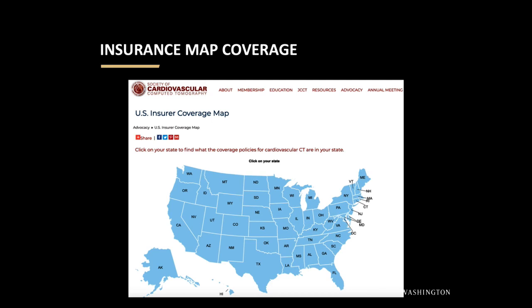So Hans, it seems like in the PROMISE trial, a lot more patients get stented, but they don't derive any real clinical benefit from it. Is there any comment on that? But we know that, I think. If you stent stable chest pain, there's no clinical improvement in outcomes. It seems like the CAT scan, though, is leading you to put more stents in.